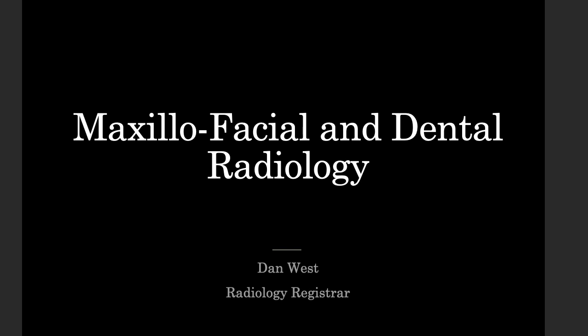So I asked people if they would like any teaching on any particular topics, and two things that came up that were quite linked: maxillofacial emergencies and dental radiology. So I thought I'd speak about those for you today. Sorry I didn't get to do this in person, but I hope having this video would be useful for you and you'll be able to refer back to it if needs be, because I know we don't really do a lot of dental and max fax plain film particularly, and I hope it might be interesting.